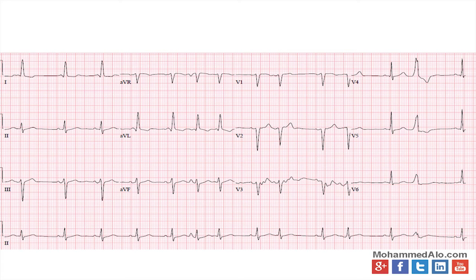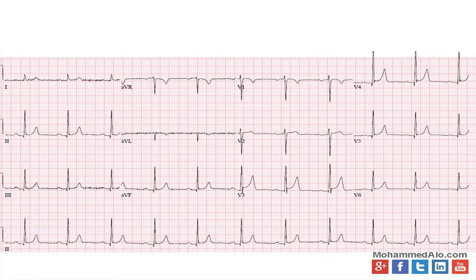If you look at the rhythm strip at the bottom, it also matches pretty well. The PAC is very narrow and the PVC is quite wide.